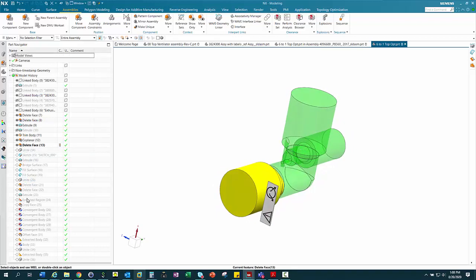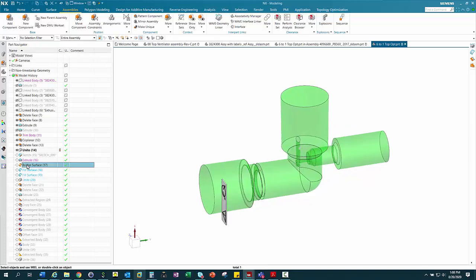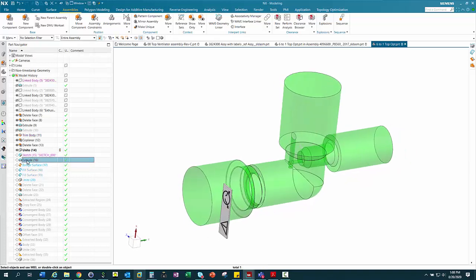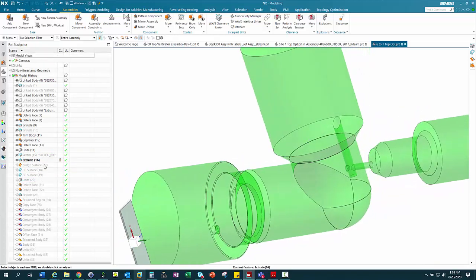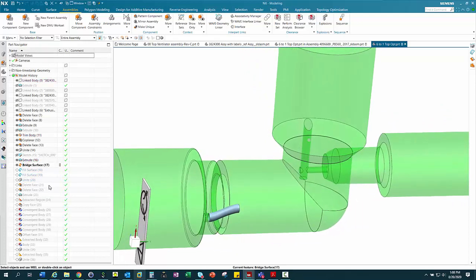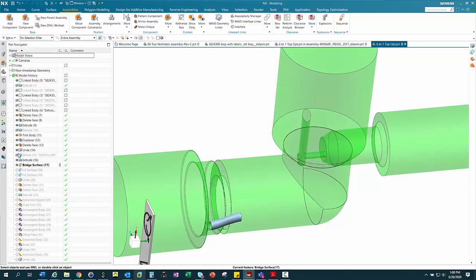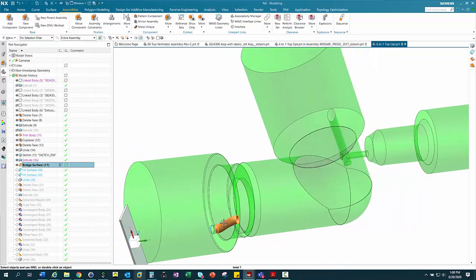So if we kind of walk through our design, you'll kind of see how we've got this information. So now we united those parts together, and we're kind of rebuilding the design, but you see how we're able to create a bridged piece of airflow.